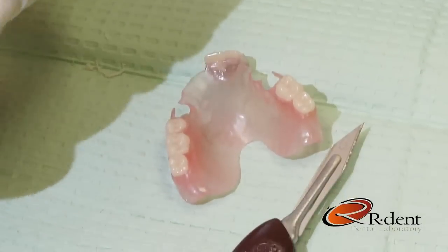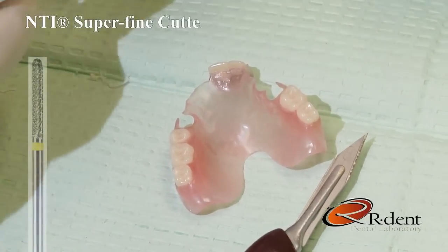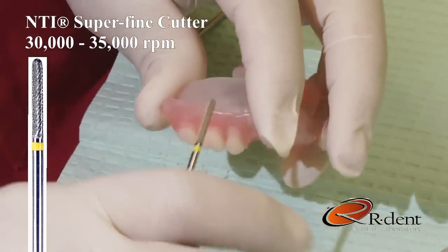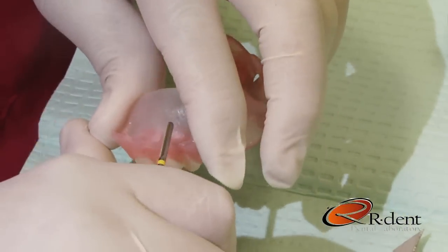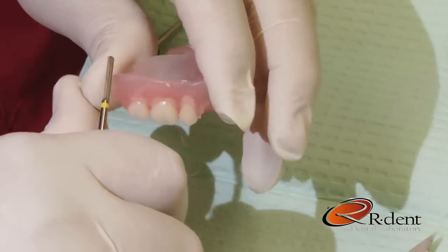When adjusting the periphery borders, I like to use the superfine cutter at approximately 30 to 35,000 RPMs, pulling the cutter across the periphery surface of the partial.